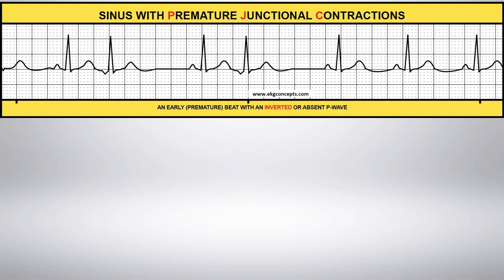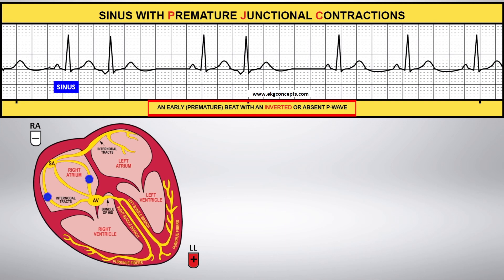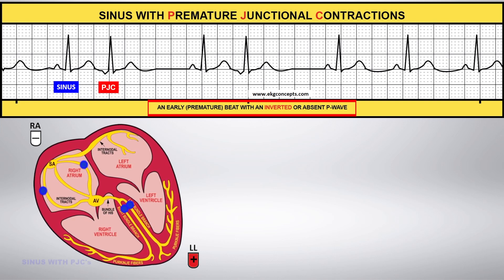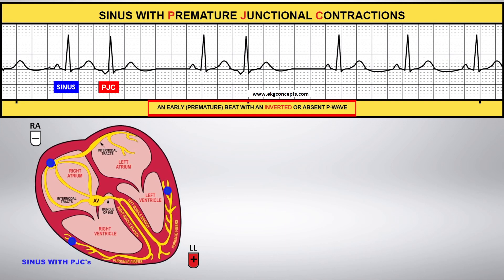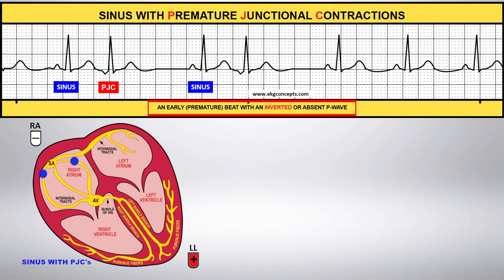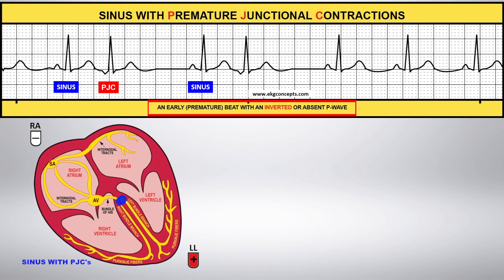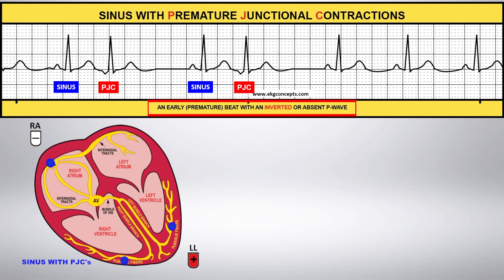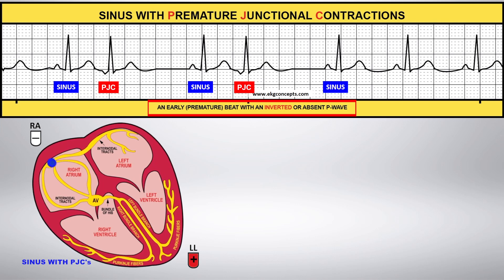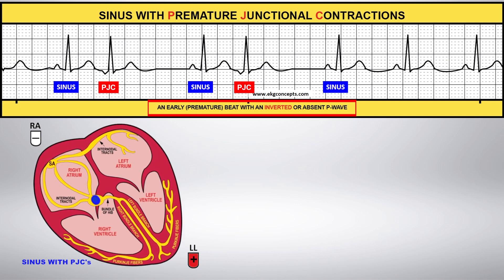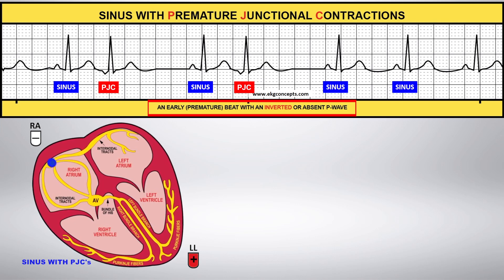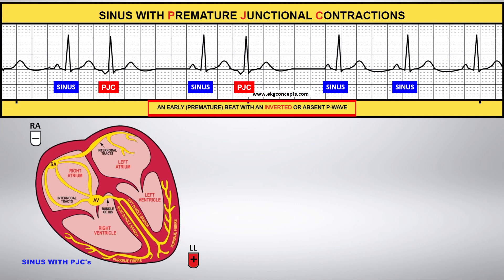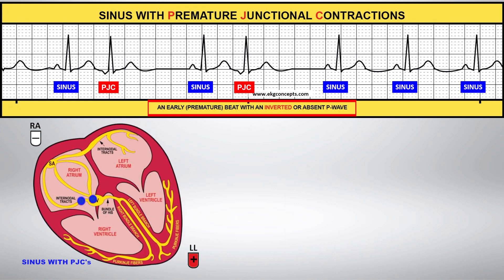Sinus with PJCs occurs when a premature beat originates in the AV node or the tissue surrounding it. The impulse occurs before the next beat of the underlying rhythm. Since the impulse originates from the AV node, it travels backward toward the atria and toward the negative lead, which causes the P wave to be inverted.